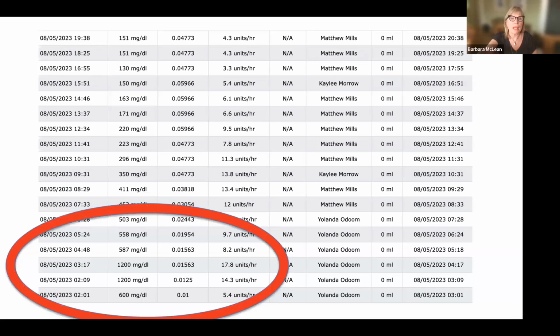I think probably all the same thing. Just wanted to bring to your attention this patient, who was a medical ICU patient boarding in the ED. The medical attending said to the nurse, I don't believe in Glucommander. I don't like it. I want you to just put the patient on 10 units of insulin.